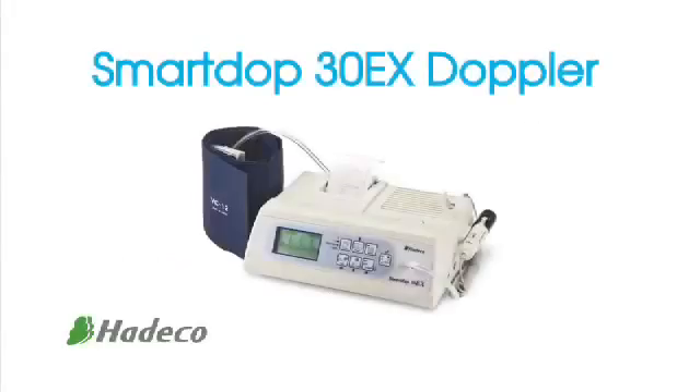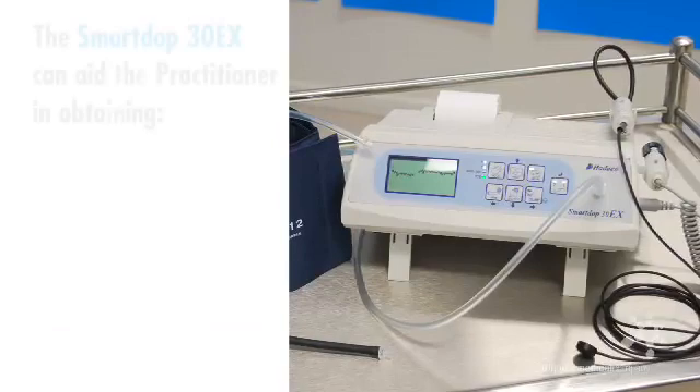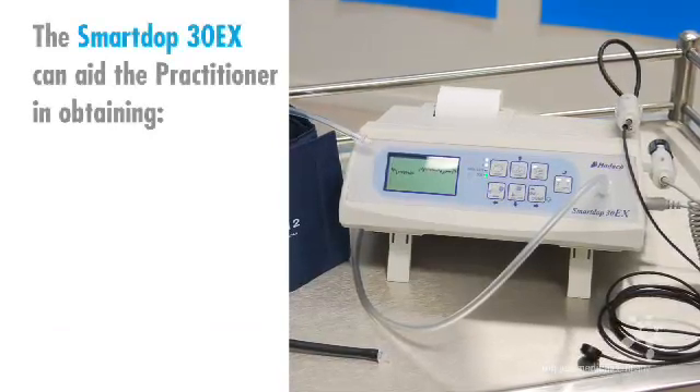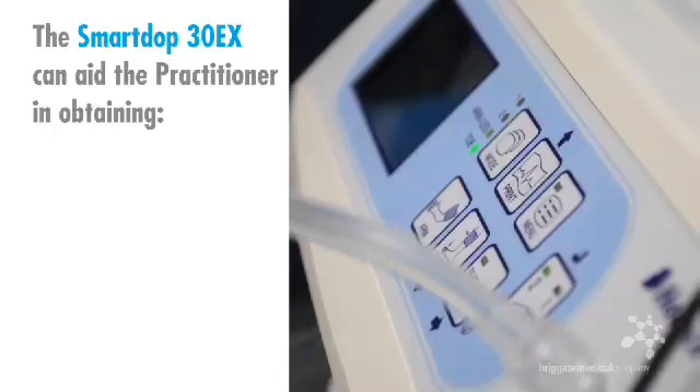The SmartDop30EX is the most advanced model offered by the Japanese Doppler manufacturer HEDECO. This demonstration will illustrate how the automatic cuff inflator-deflator within the SmartDop30EX can aid the practitioner in obtaining the following.